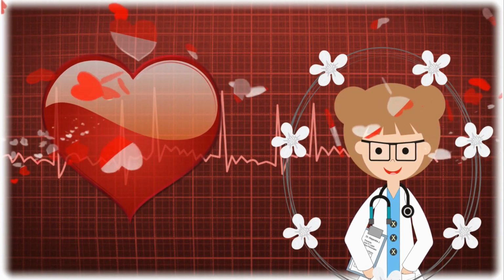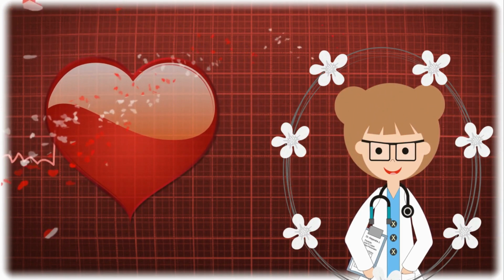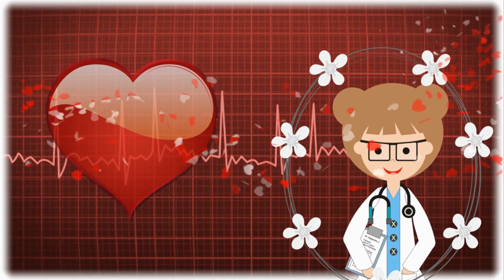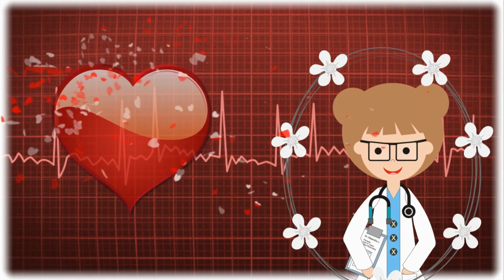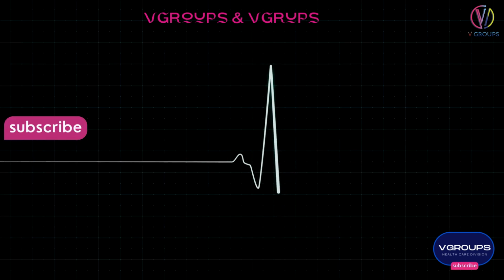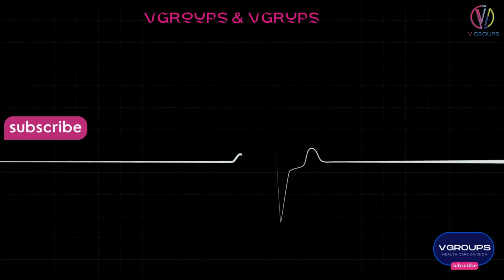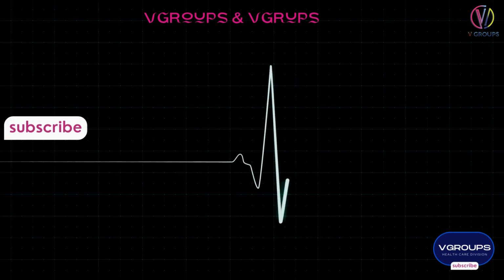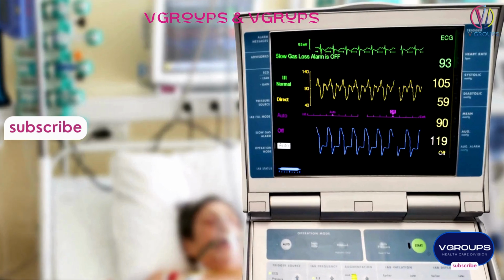The electrocardiogram, ECG, machine serves the primary function of recording the electrical activity of the heart. The machine detects and amplifies the electrical signals generated by the heart during each heartbeat, producing a graphical representation known as an ECG or EKG. Here's an overview of the ECG machine's functions.